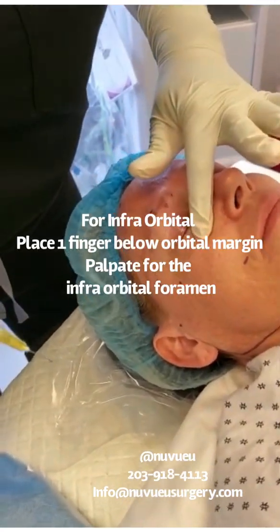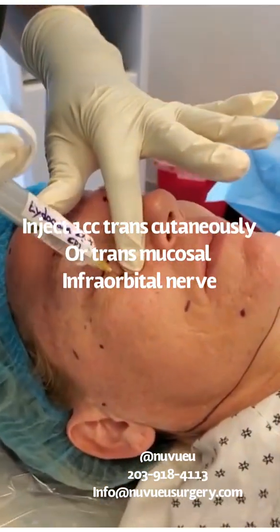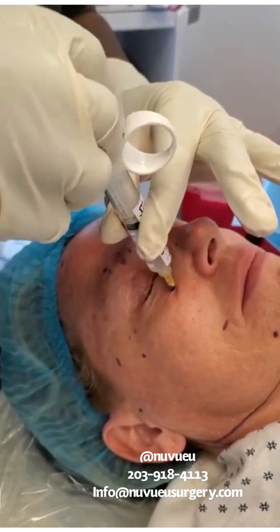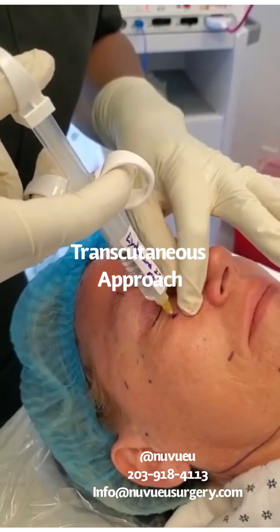You're going to feel for the notch, which is right there. You're going to go down, all the way down. I'm going to aspirate. And you just want to inject right in that area.